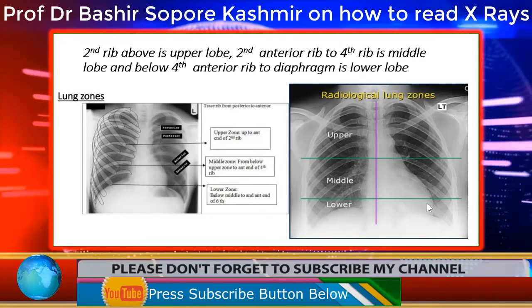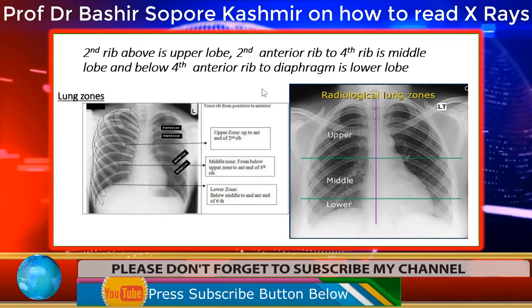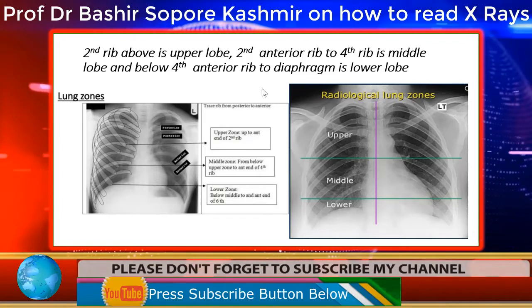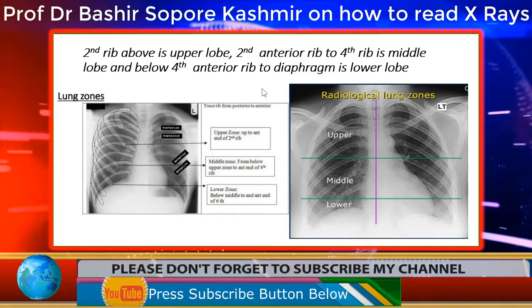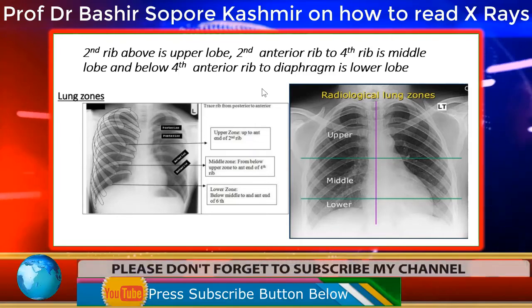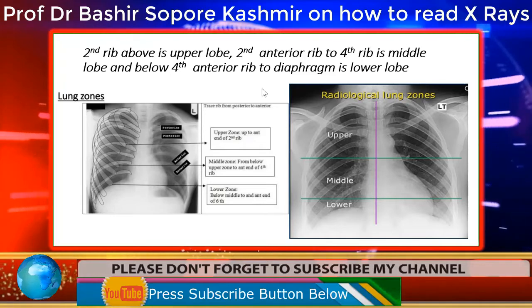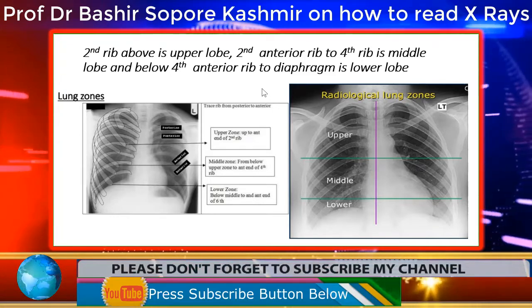Then let me tell you here that we also divide the lungs into three zones as far as X-ray is concerned. But I have seen mostly the students, when they talk about the examination of the chest, sometimes they say the crepitation is in the upper zone, crepitation is in the middle zone. We don't say like that. That is wrong. That should not be said like that.